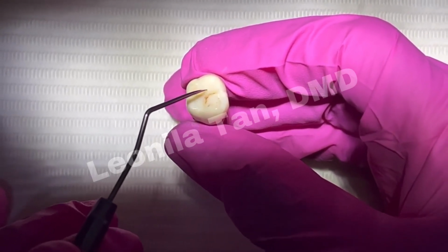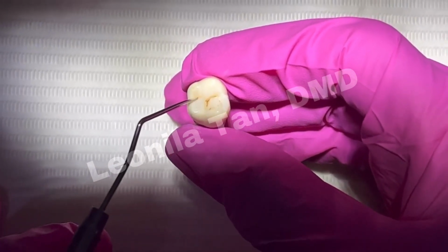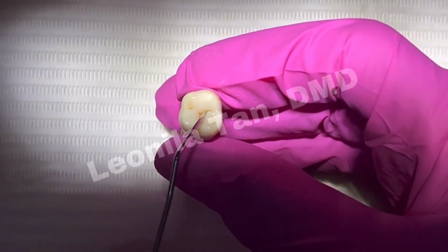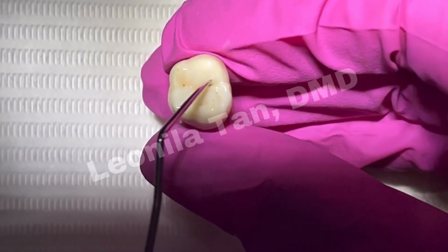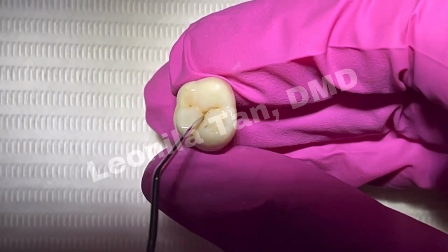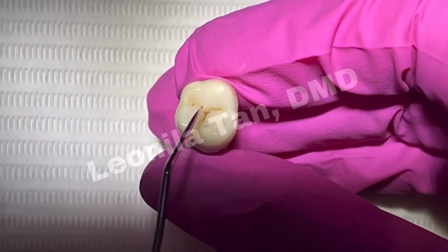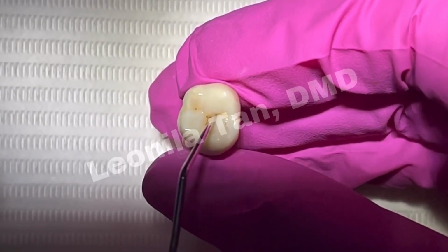So initial access form avoids touching the distal aspect. The point of entry is always on the center of the mesial groove. So here you have your triangular fossa, you have the central groove, and you have here your buccal groove. So if you look very closely, your burr is always directed on the middle of that central groove.